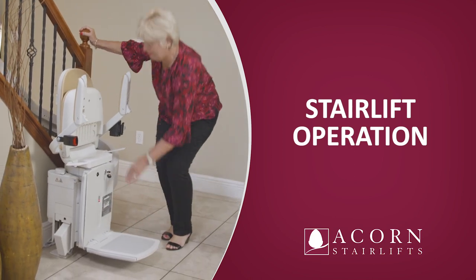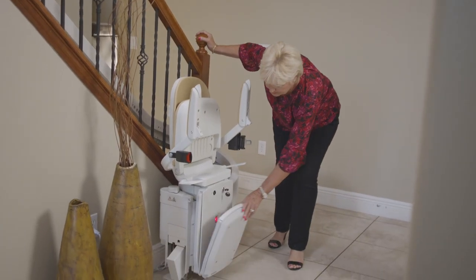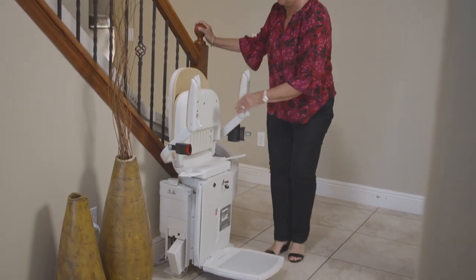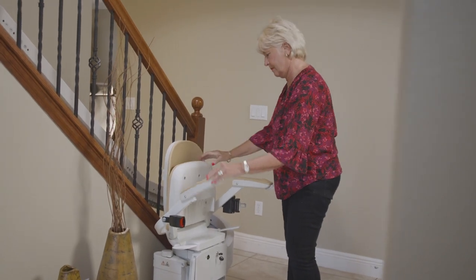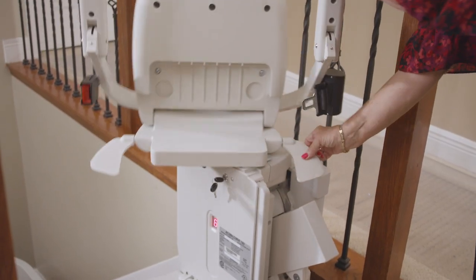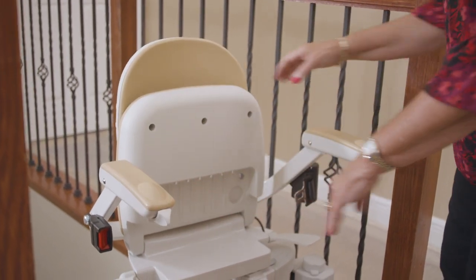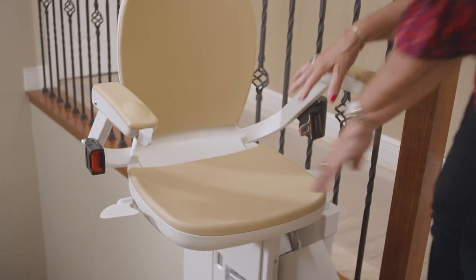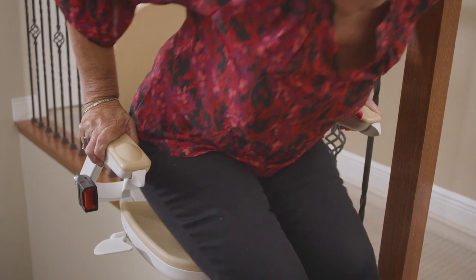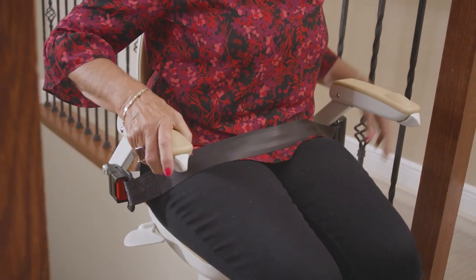Stairlift operation. When using your stairlift, follow these steps. Lower the footrest. Lower the seat and arms. When getting on the stairlift at the top of the stairs, hold down one of the swivel paddles and swivel the seat until it locks into a position where the seat is facing away from the steps. Sit in the seat and fasten the seat belt. Swivel the seat until locked in the operating position.